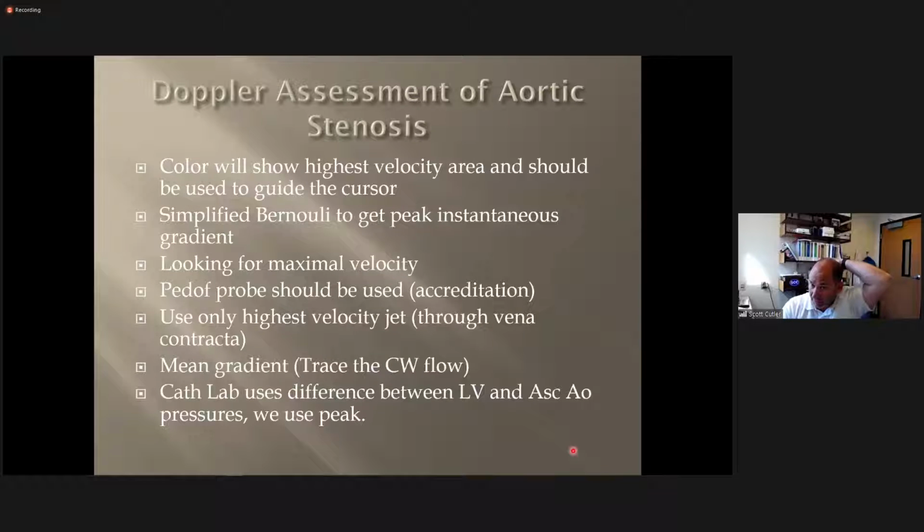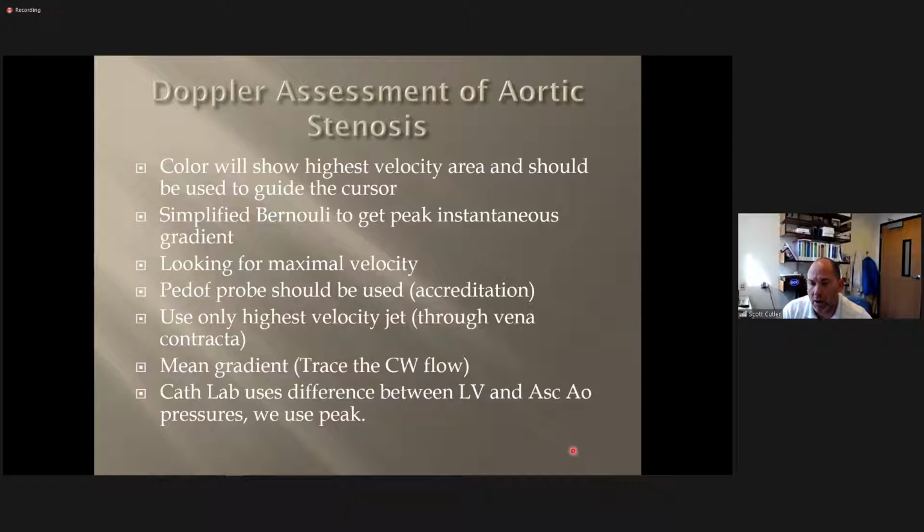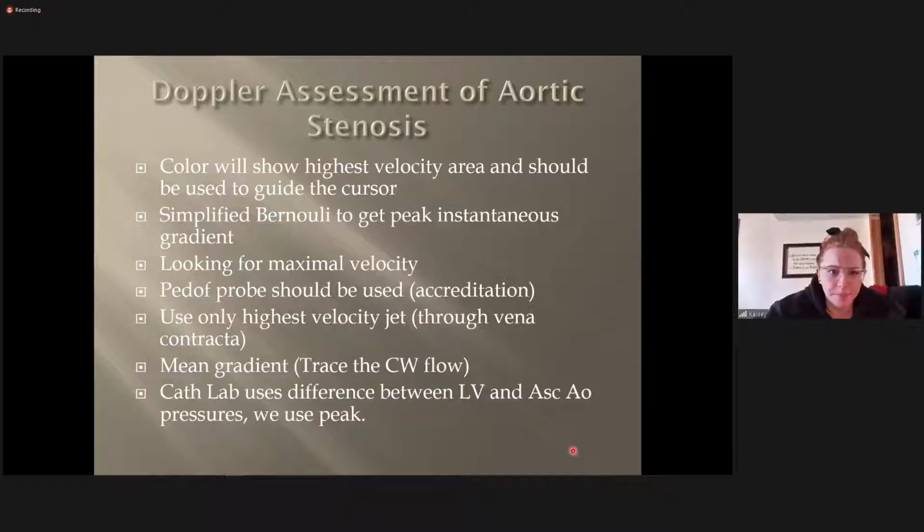Yes, we want to look at dilated post-stenotic dilation in the aorta. We want to see that the sinuses of Valsalva or the aortic root is in normal size, because it can dilate after a stenosis as well. But those are both secondary. How common is it that a lab does do a 2D aortic valve area in short axis? As far as tracing it, I would say not common. Most often it's done with continuity equation using Doppler. Okay. Yeah, that's by far most common.